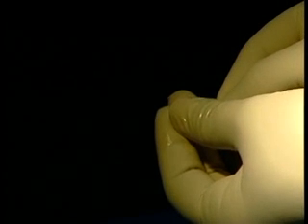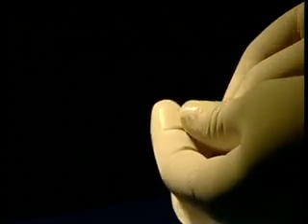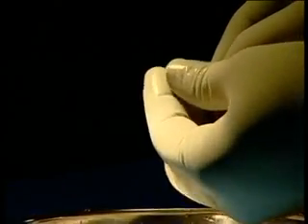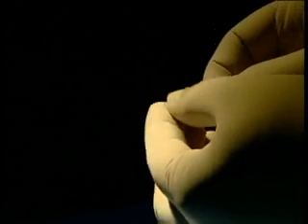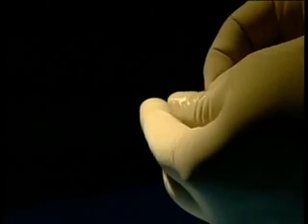Then you can't do a retrograde for a muscular VSD device, right? Yes. Then it has to be an arteriovenous loop. No, you can do retrograde muscular VSD closure with the larger devices, but you need to use the larger sheaths. We do a retrograde technique using the PDA sheath. If you have a small baby, the problem is the larger sheaths you have to use through the artery. Hence, probably it is not recommended. We have to wait for the bigger devices of ADO2 to come into market.